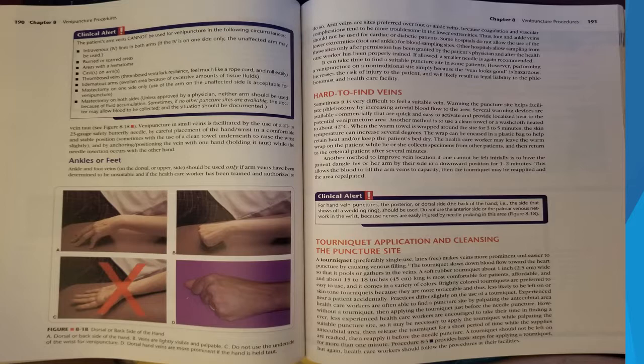Warming the puncture site helps facilitate phlebotomy by increasing arterial flow to the area. Several warming devices are available commercially that are quick and easy to activate and provide localized heat to the potential venipuncture area. Another method is to use a clean towel or a washcloth heated to about 42 degrees Celsius. When the warm towel is wrapped around the site for 3 to 5 minutes, the skin temperature can increase several degrees. The wrap can be encased in a plastic bag to help retain heat and/or keep the patient's bed dry. The healthcare worker may leave the warm wrap on the patient until he or she collects specimens from other patients and then return to the original patient after several minutes.